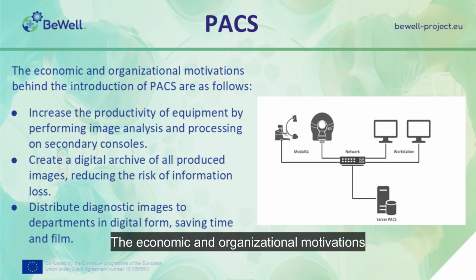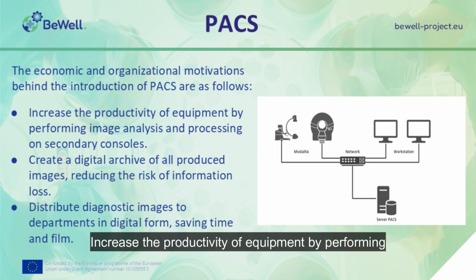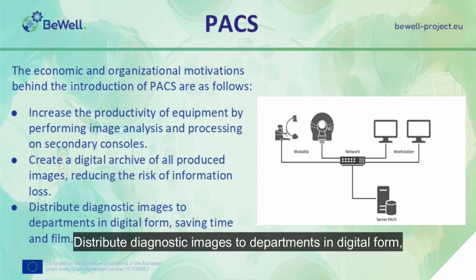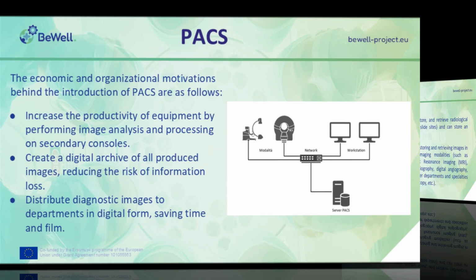The economic and organizational motivations behind the introduction of PACS are as follows. Increase the productivity of equipment by performing image analysis and processing on secondary consoles. Create a digital archive of all produced images, reducing the risk of information loss. Distribute diagnostic images to departments in digital form, saving time and film.